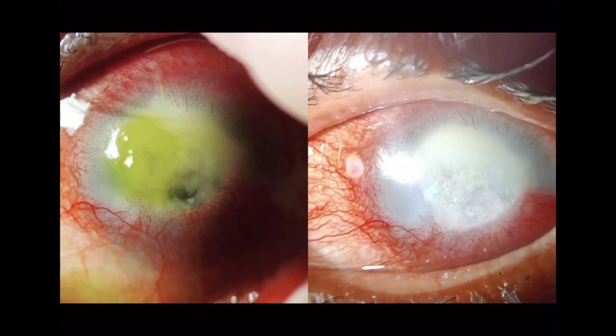Here are the pre-op and the post-op pictures of the patient. You should patch for a few hours and then remove, and start the medications after that.